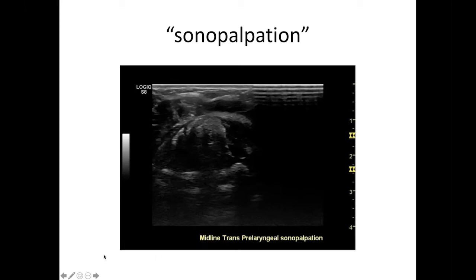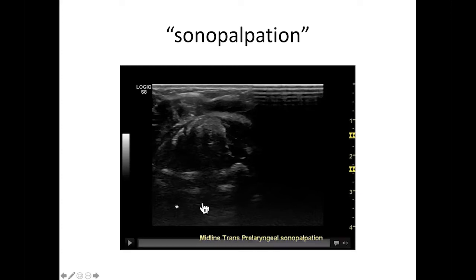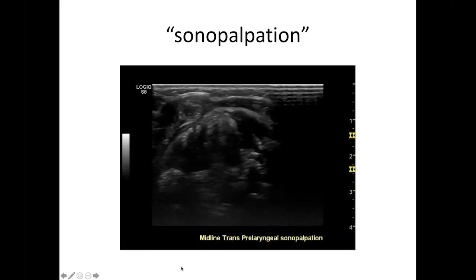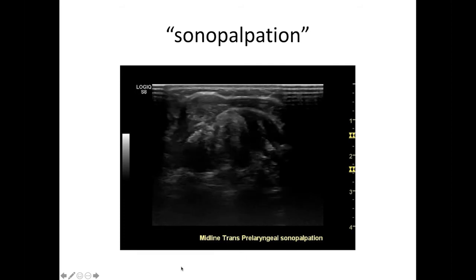This is an example of sonopalpation, where you can use your non-transducer-bearing hand to palpate the patient and their pathology while you're examining them, and see whether structures move with relation to each other.